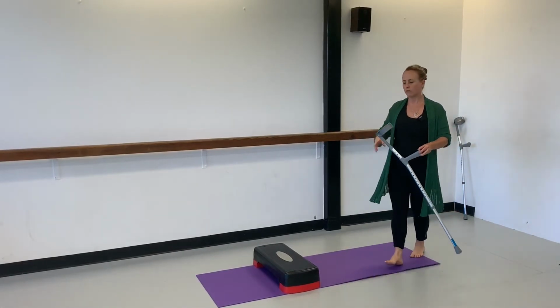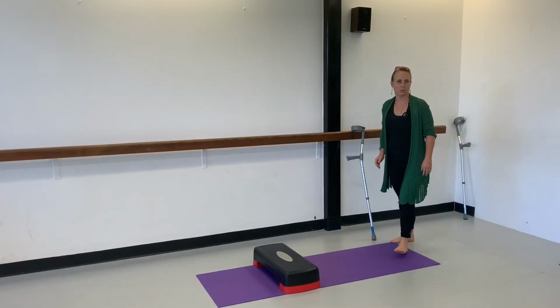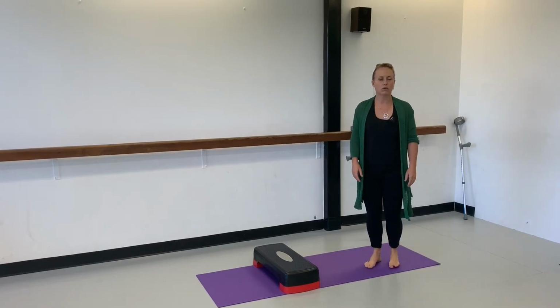Once you feel more comfortable, you'll find that you naturally start forgetting your crutch and just walking around the house without it, and that's fine as long as you're not limping, because if you're limping then you need to stick with crutches for a little bit longer. Most people are on crutches for a couple of weeks. Everyone's a bit different, but by the 6-week mark everyone's much the same. So you'll ditch your crutches when you're ready and don't worry about when that is.